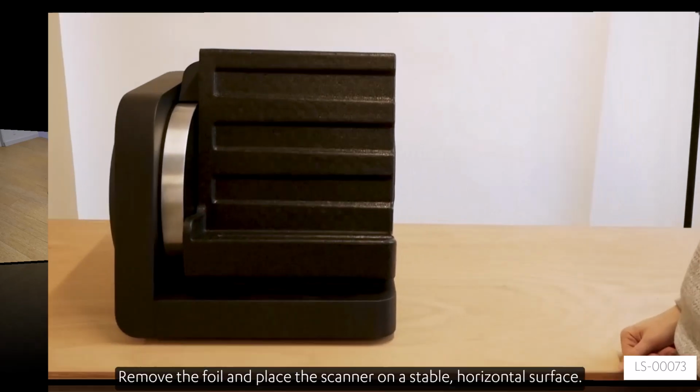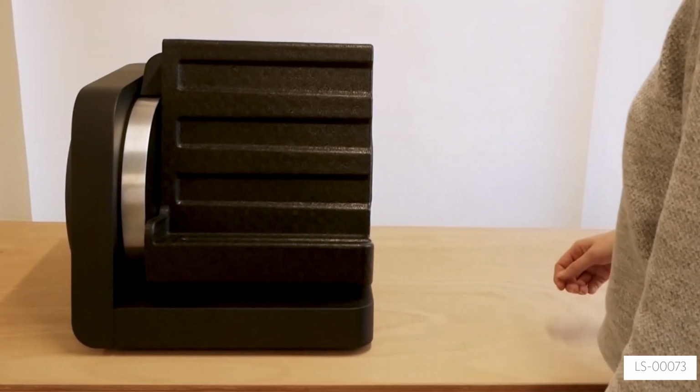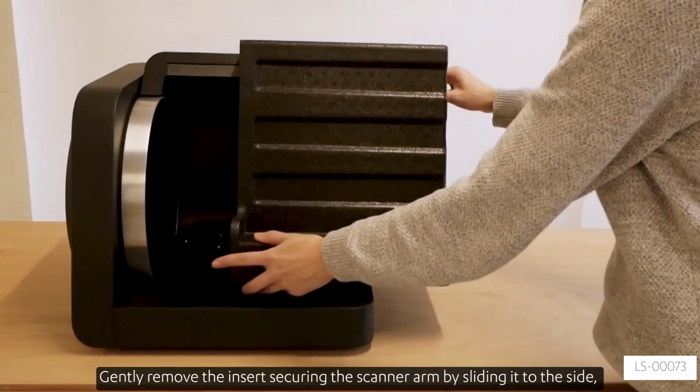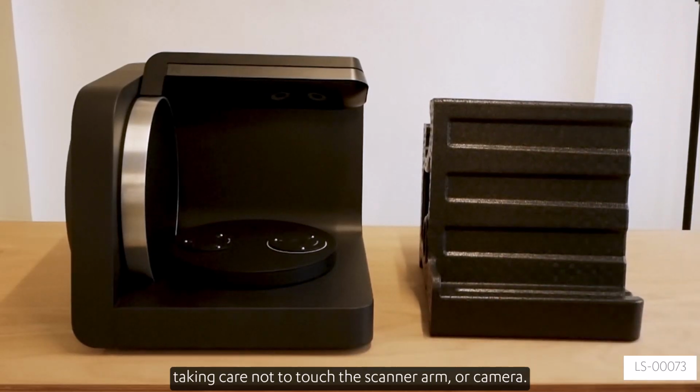Remove the foil. Place the scanner on a stable horizontal surface. Gently remove the insert securing the scanner arm by sliding it to the side, taking care not to touch the scanner arm or camera.